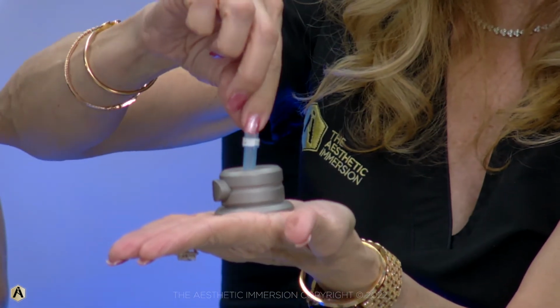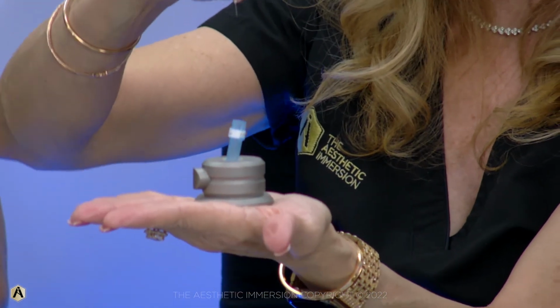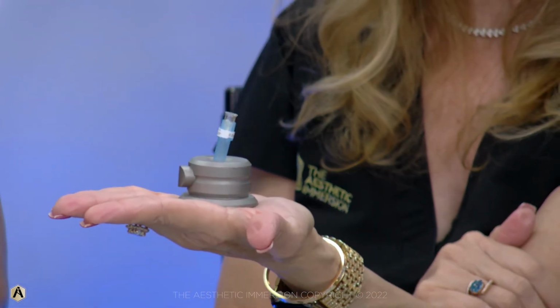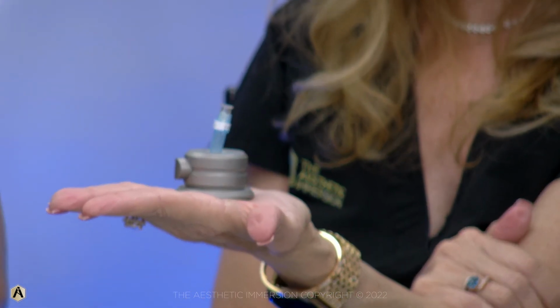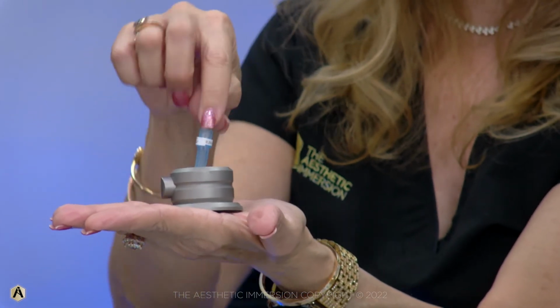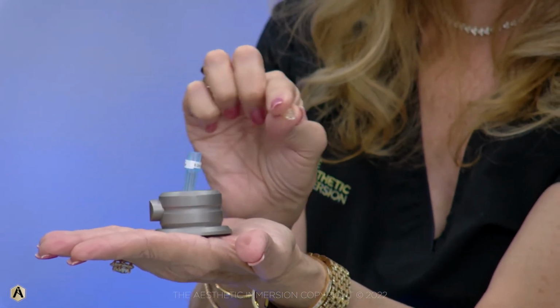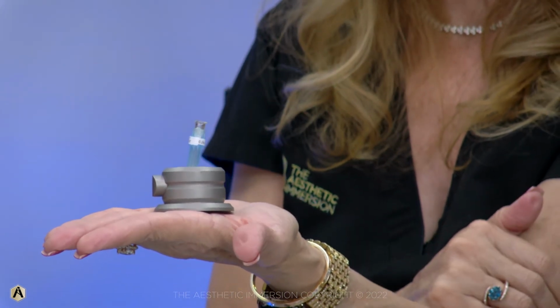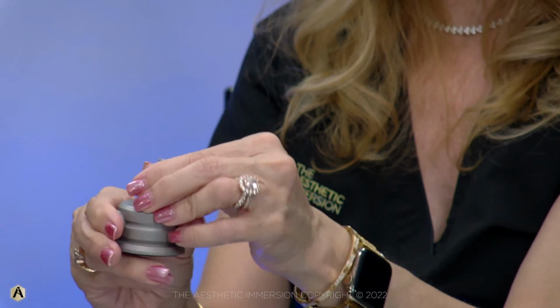And when I want to use the needle, say to make a hole for threads, I just pull it out and I can put it right back in here, so it reduces the risk of any puncture. And it's heavy enough to hold down. So I put my 18 gauge needle in here when I'm doing threads, and I take it out, make my portholes, and put it right back in there, and it holds it, it's sterile, and it keeps it nice and clean. So this is by TSK.